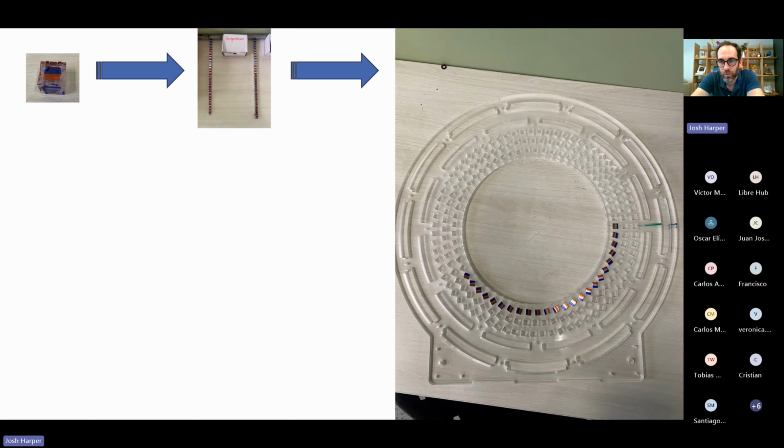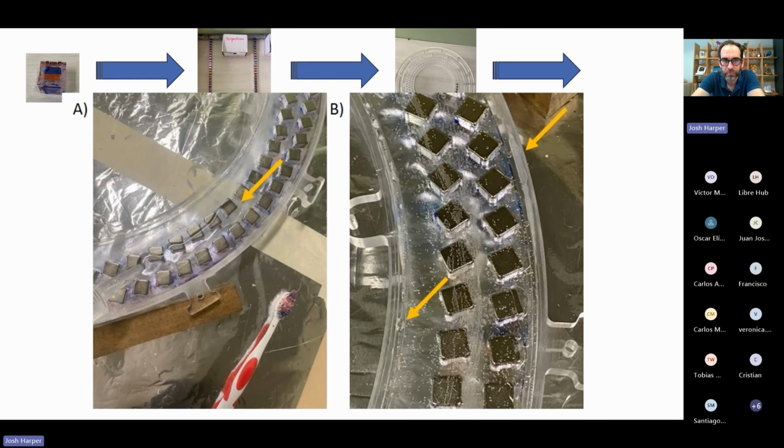And each of those little slots for the magnet is cut with a precision of 0.1 millimeters with a CNC mill. And this is really not a tolerance that's terribly difficult to keep, but it does need to be kept, because small deviations in tolerance will really destroy the homogeneity of the magnetic field, which is one of the reasons why we stuck with our supplier in the Netherlands. So here we see a partially filled ring.